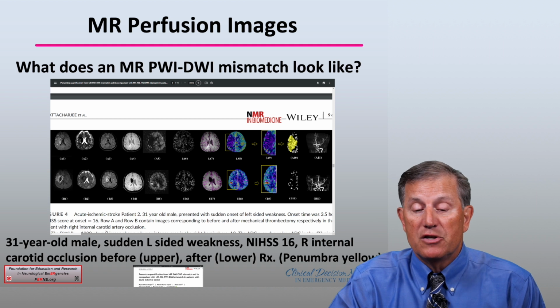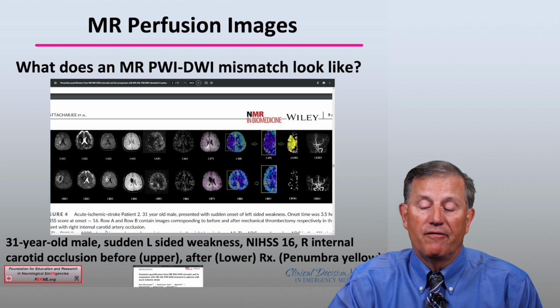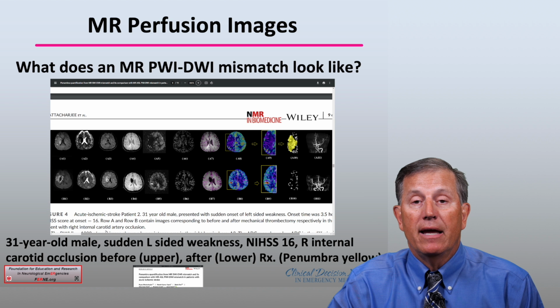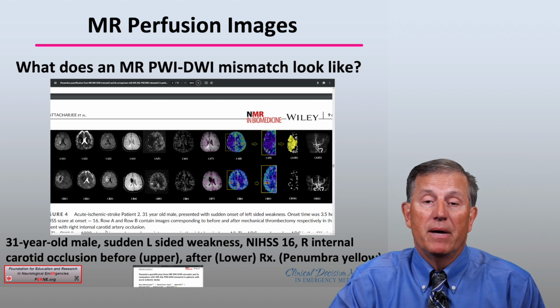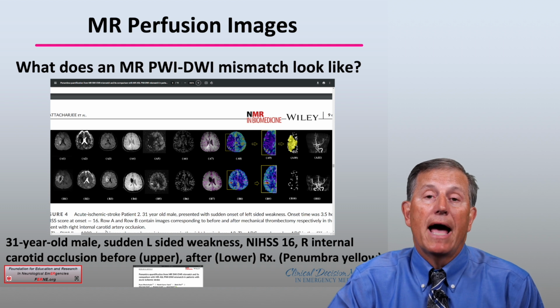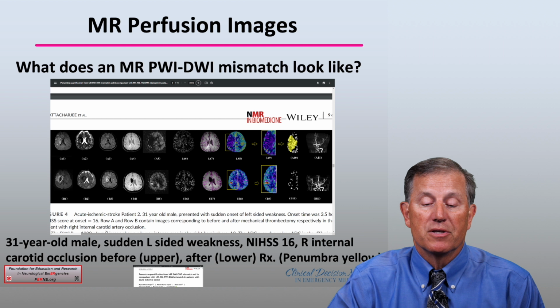And so you can see in these two patients who had carotid occlusions as a cause of their stroke, with MR, you can identify an ischemic penumbra as identified here in yellow. And you'd say, well, what was identified at the time that they did a non-contrast CT, a CTA or CT perfusion? Remember, in patients in whom the likely scenario is a middle cerebral artery being occluded due to some thrombus or embolus, you might use the MR as an alternate therapy or diagnostic for determining the cause of the stroke in patients that are not typical, those who are young, for example, as compared to older patients.